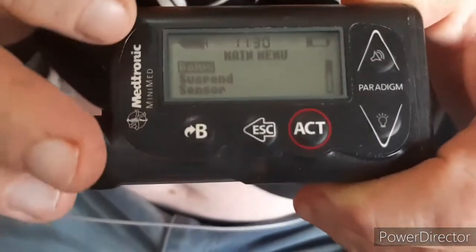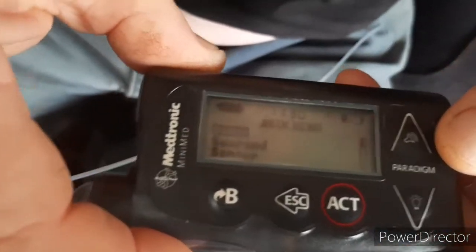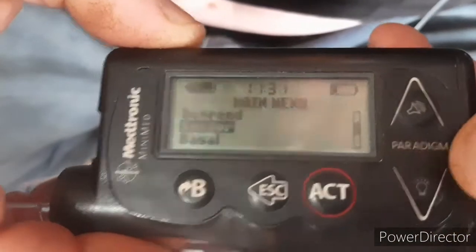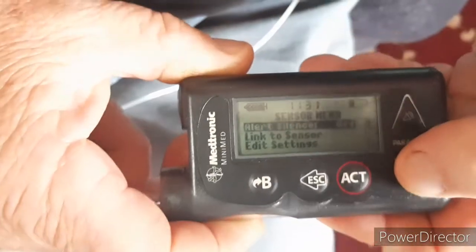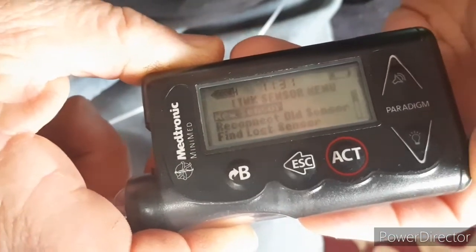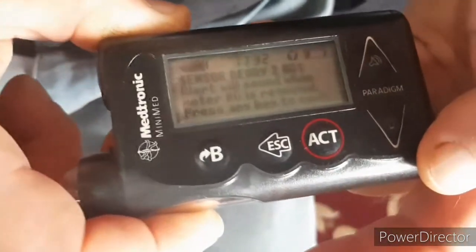On the pump screen you'll see three selections: bolus, suspend, and sensor. Select sensor and press ACT. On the next screen, the middle choice is 'link to sensor' — go down to that and press ACT. Then press 'new sensor' and press ACT again.